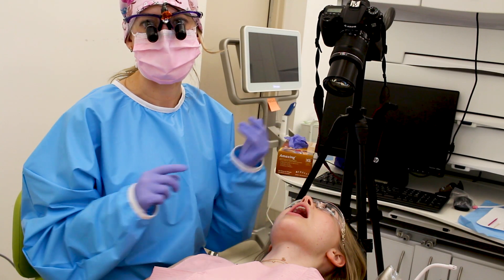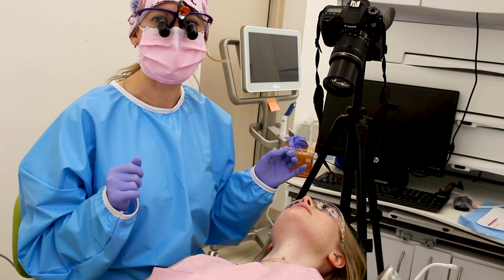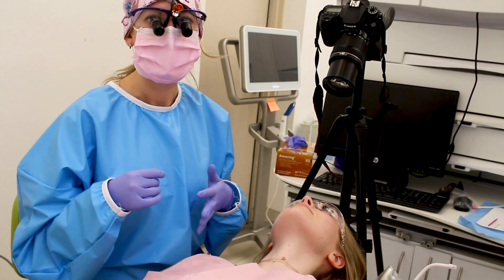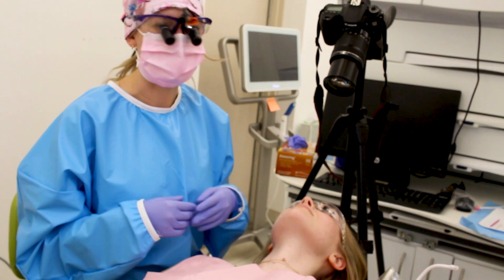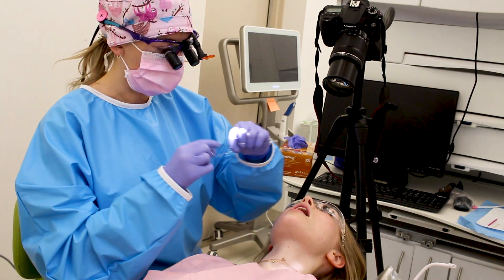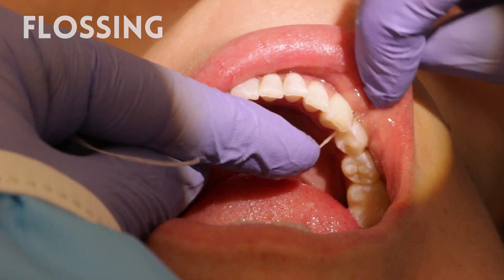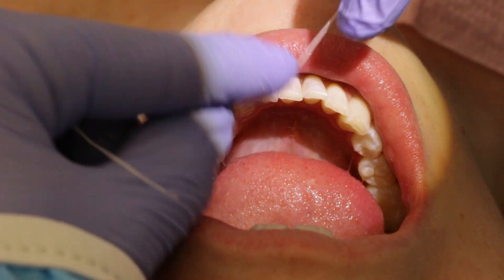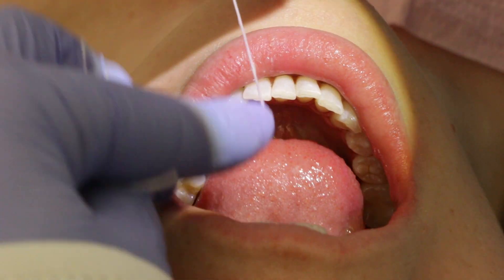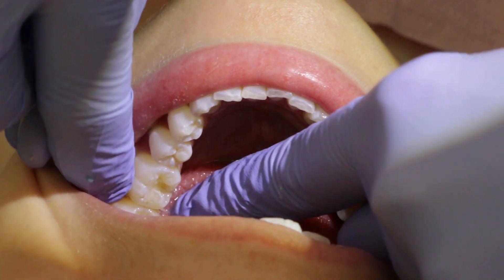At the end there are usually two things I finish up with: floss and fluoride. We floss first to make sure we got all that pumice out and that everything's nice and clean. Then we're going to paint on a little bit of fluoride varnish. I'm going to wrap the floss around my middle fingers, have a little one-inch gap, and we're just going to floss her teeth. It's really important to have your hygienist go down through the gumline and go up one side of the tooth and up the other side to keep it nice and clean.